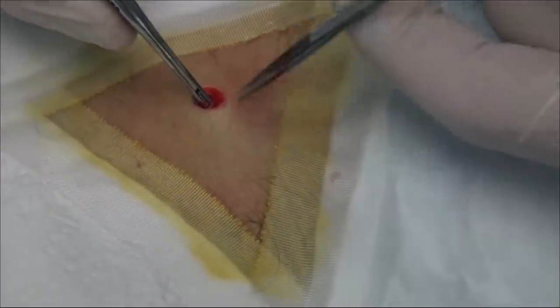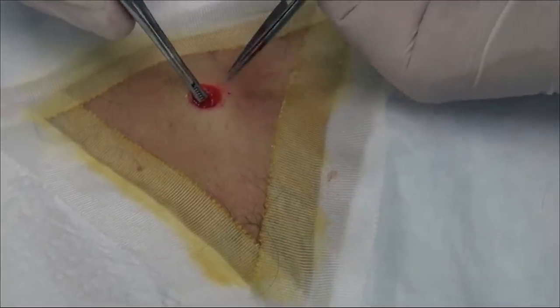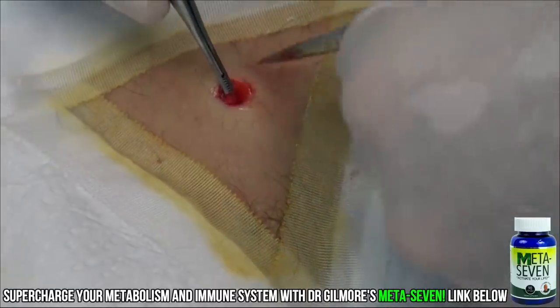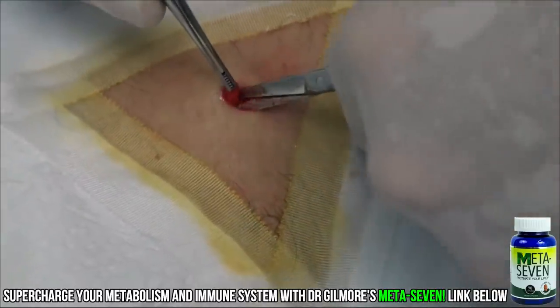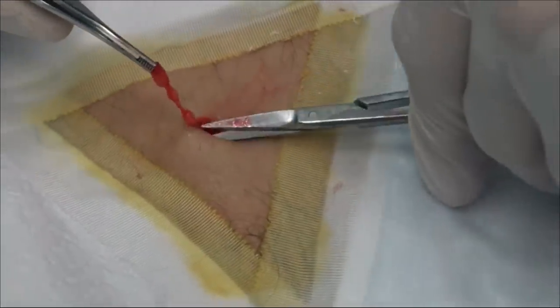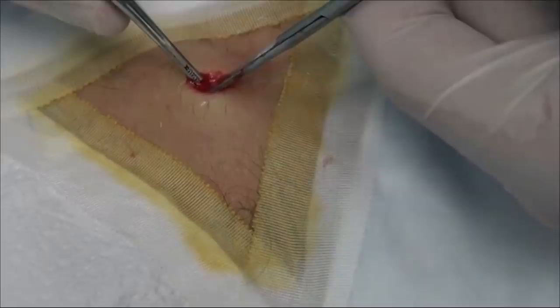It's okay. And the truth is, if I don't get everything out of there, it could come back. Snip, snip. But I'm not gonna let you leave till we've got it all taken care of. We've got a long weekend. There it is right there — that's the rest of it. It's just the sack material was hiding in there a little bit. We've got it all. I can't quit until I really satisfy myself that I've got all of it out.